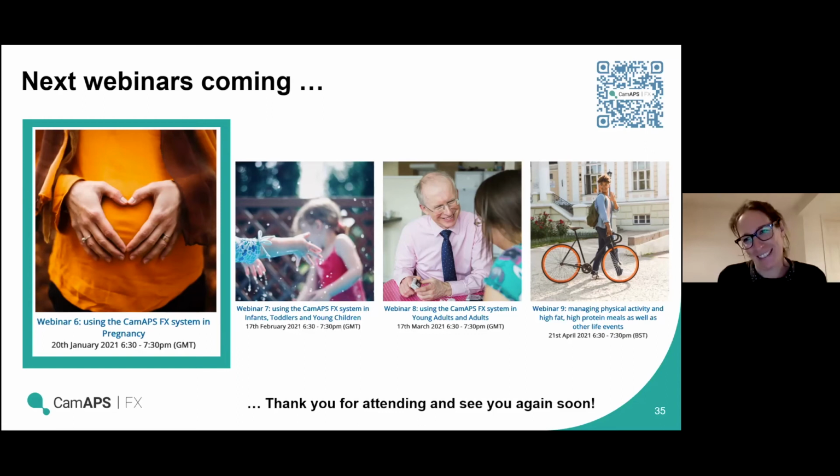I think there's lots of things to take into consideration, isn't it? I think the arrows in the CGM are probably the thing that I would base my decision on. If the arrow was flat or starting to rise, I'd have a bit of confidence that things are starting to turn just because closed loop has backed off insulin delivery. So you might be able to get away without taking any. It slightly depends on your patience and willingness to watch your CGM data, which is a good 10 minutes to wait for the next couple of dots to come in. And exactly as you say, looking at the insulin delivery leading up to that point.